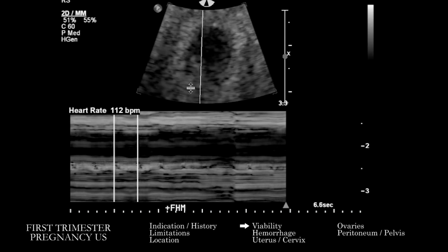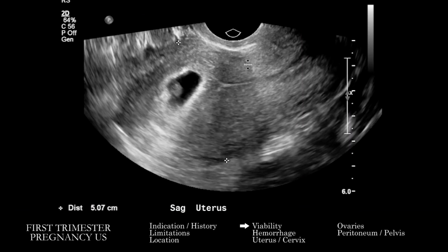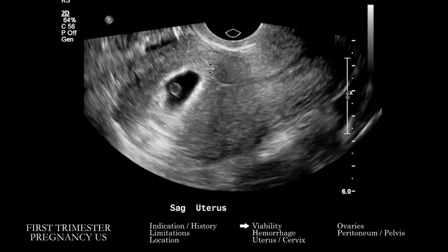It can be useful also to correlate that with normal values for the gestational age in terms of fetal bradycardia or tachycardia. There are charts for this. And then getting a sense and comparing any of these measured quantitative values for the currently accepted criteria for suspected or confirmed failed early pregnancy, or non-viable early pregnancy, as we'll say. So we've gone through and looked at some of the fetal measurements. It's an important thing to go through, and from the beginning, when we were looking at the overall anatomy, we've looked at the gestational sac and the yolk sac, and we've gotten those dimensions.